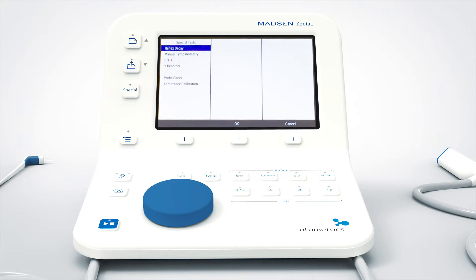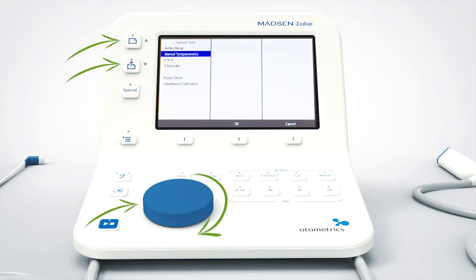Now I can see from the menu all the different tests available on my device. To select manual tympanometry, I use the wheel or these two buttons to navigate. Then you just press the OK button located here.